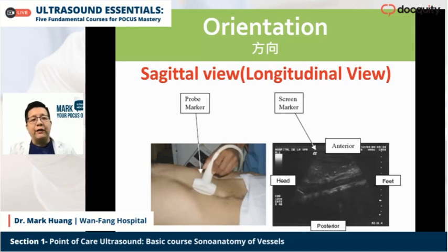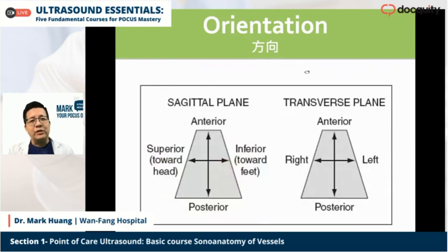You can see we have the probe marker and the screen marker. You just make them the same, in the same direction. If your probe marker points toward the head, your screen marker should be on the screen. On the screen, your left hand is the patient's head. So it will be the same way. The orientation is correct. Okay, and follow this rule.